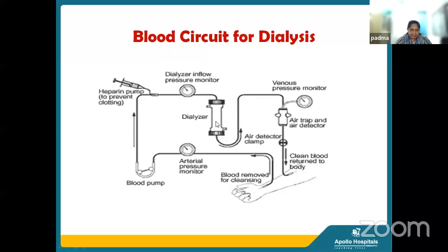So this is the dialyzer. In between the dialyzer and the blood pump, we have a heparin syringe here. This heparin goes through these tubings.